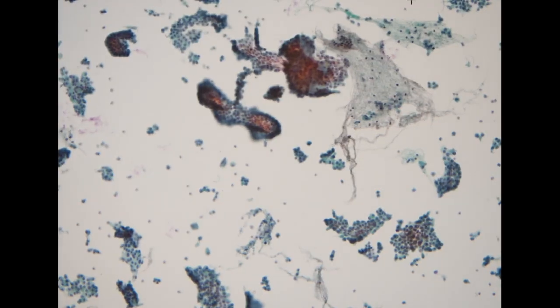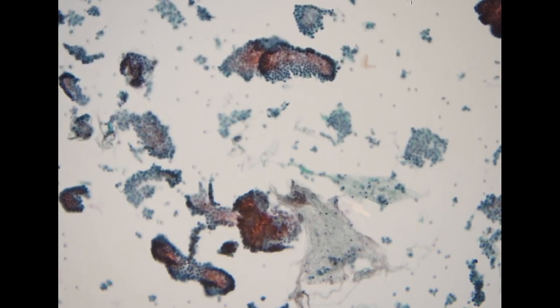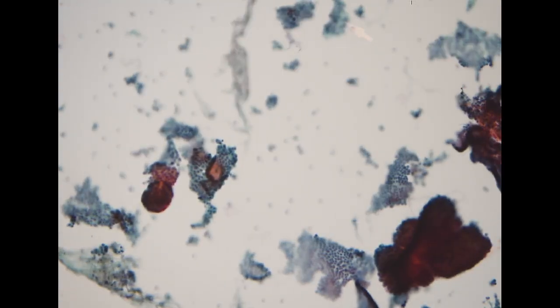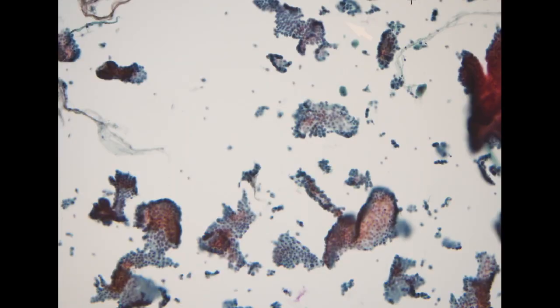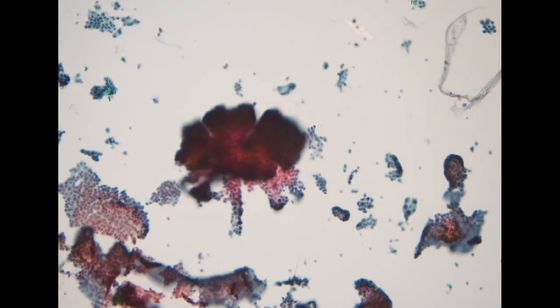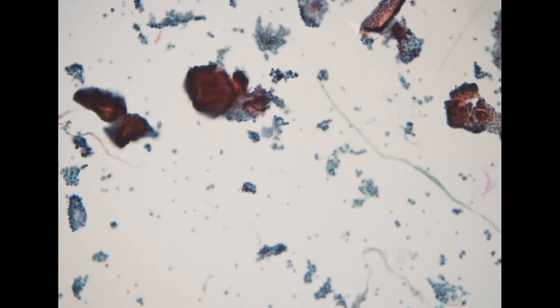Pay attention to the architectural pattern that I emphasize a lot, that this is a decapitated papilla. And you find many of these similar structures within the specimen. In the background, occasionally you can see some giant cells, but for this case, it's not very easy to find. So this is a typical papillary thyroid carcinoma.